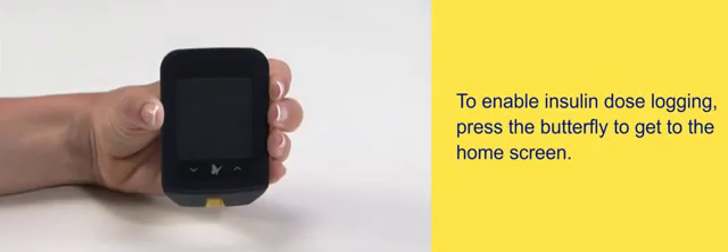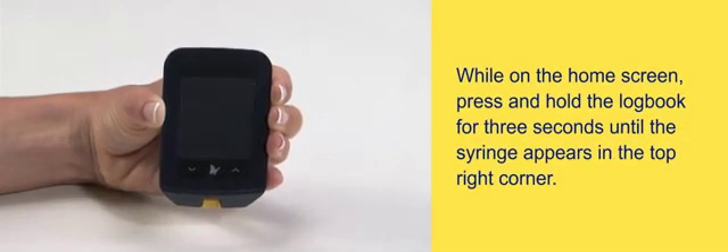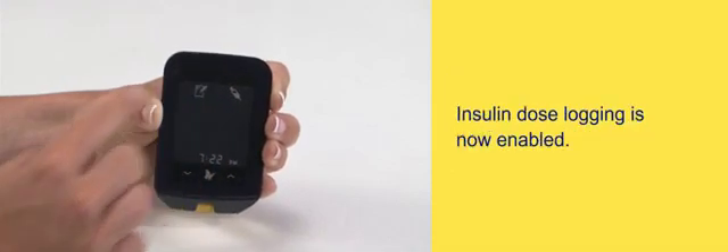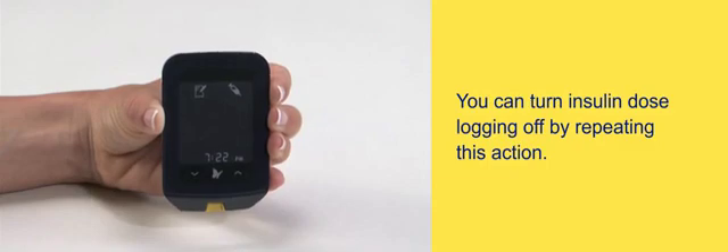To enable insulin dose logging, press the butterfly to get to the home screen. While on the home screen, press and hold the logbook for three seconds until the syringe appears in the top right corner. Insulin dose logging is now enabled. You can turn insulin dose logging off by repeating this action.